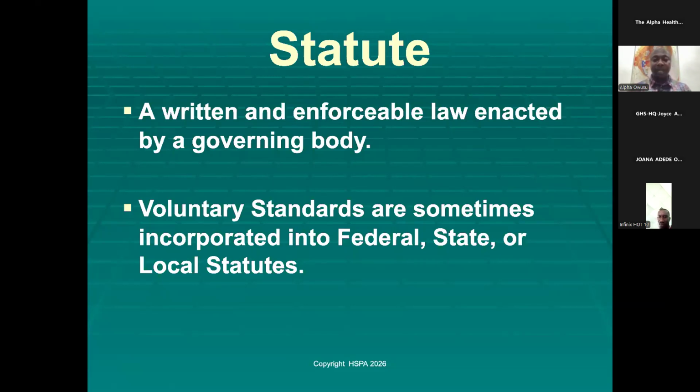You did not run the load with a biological indicator to certify that the tray is sterile, and you use it on the patient deliberately because probably we don't have another tray and you want to save the patient, and there is a problem, right? That law will be enacted, and so you will be held accountable.